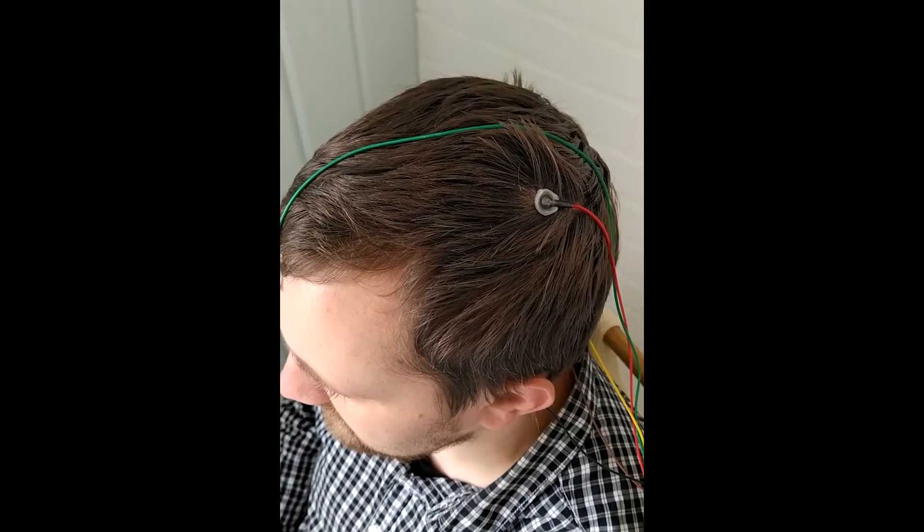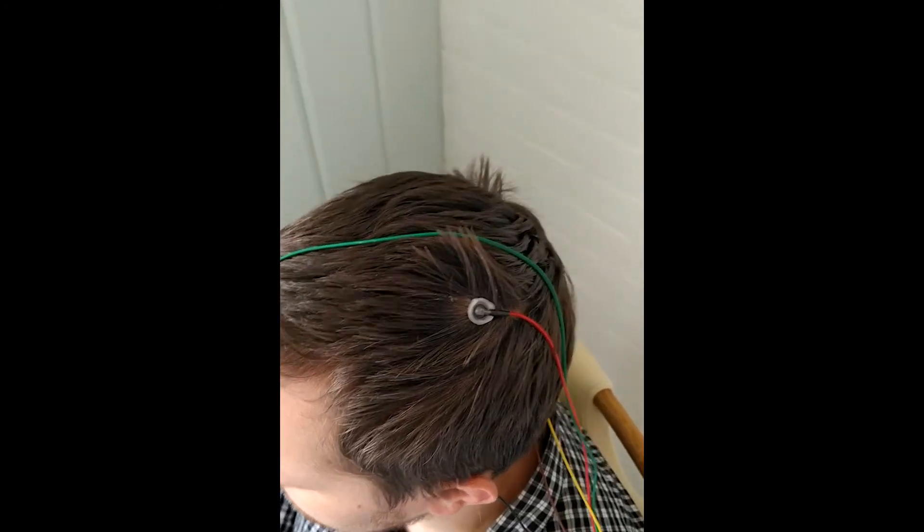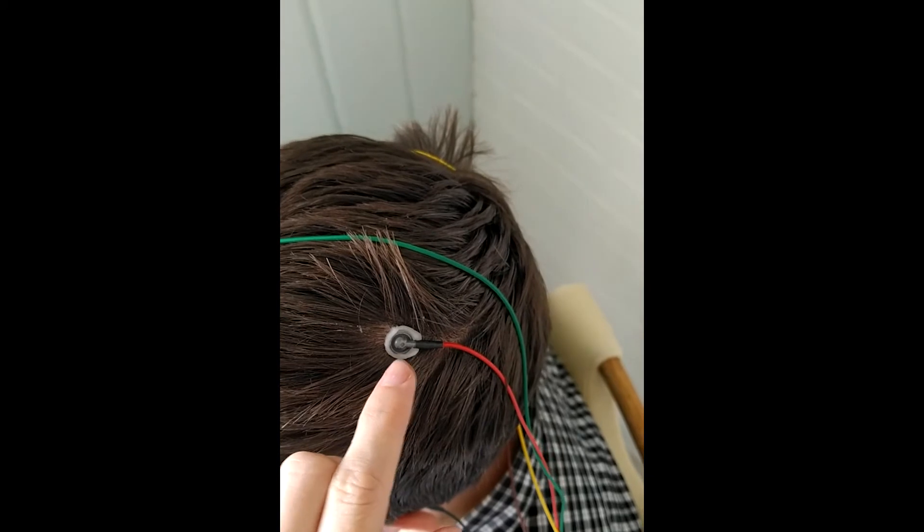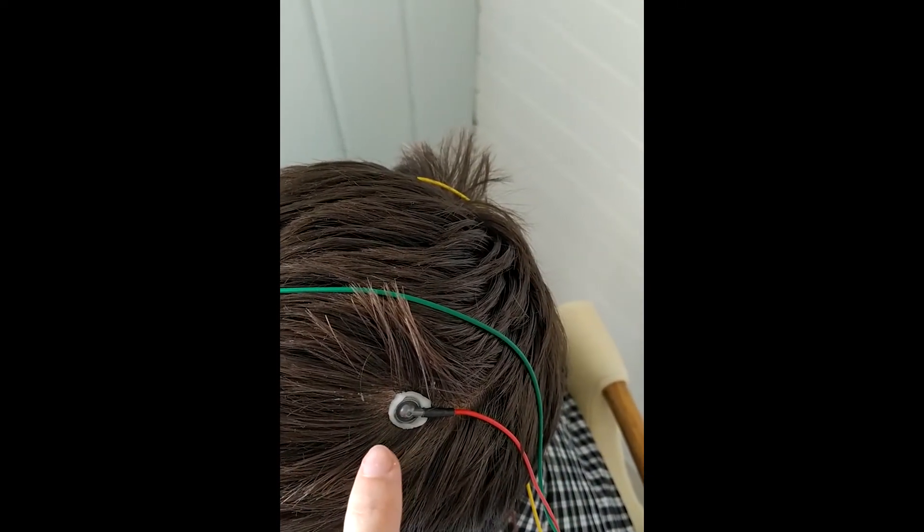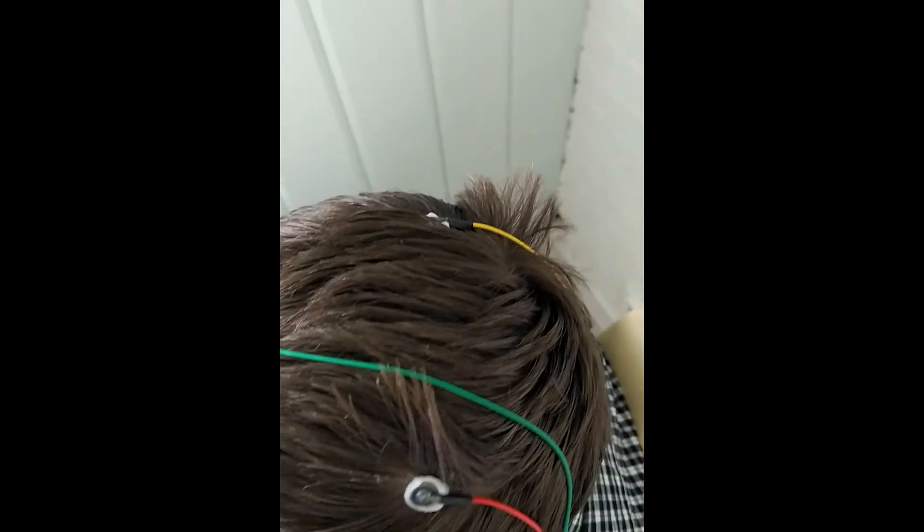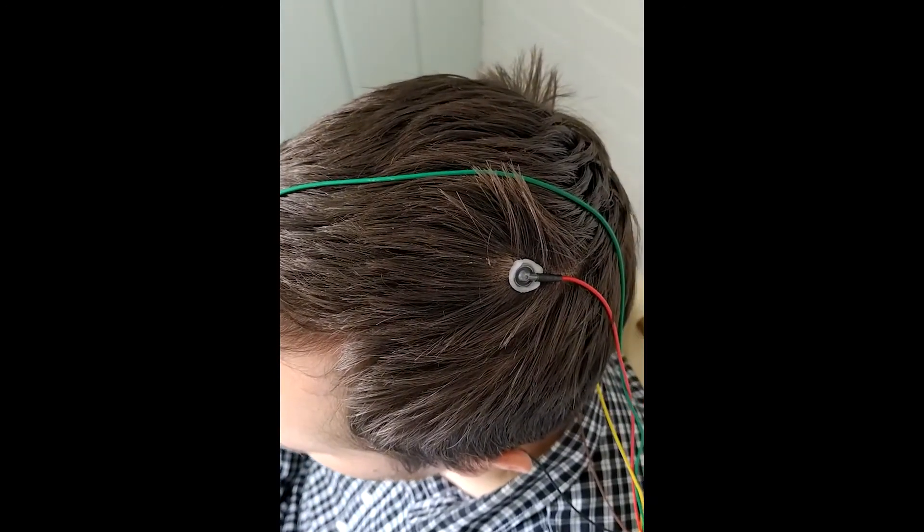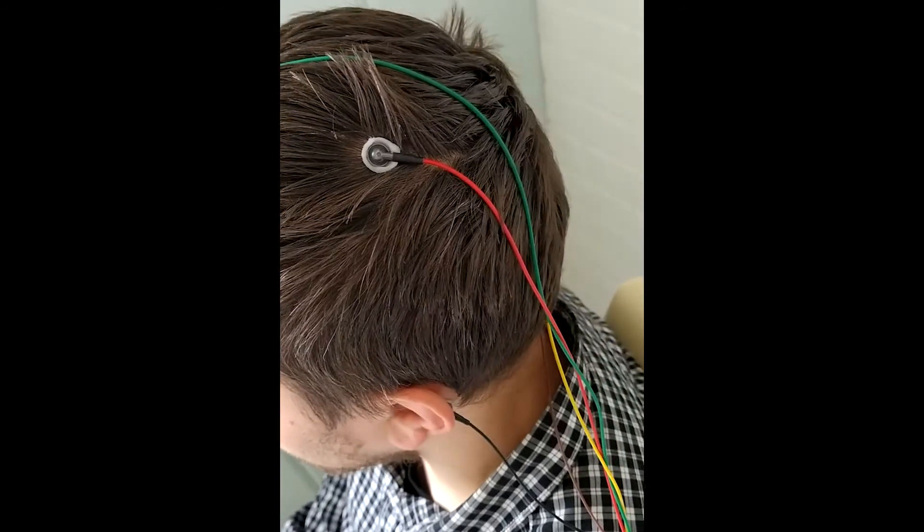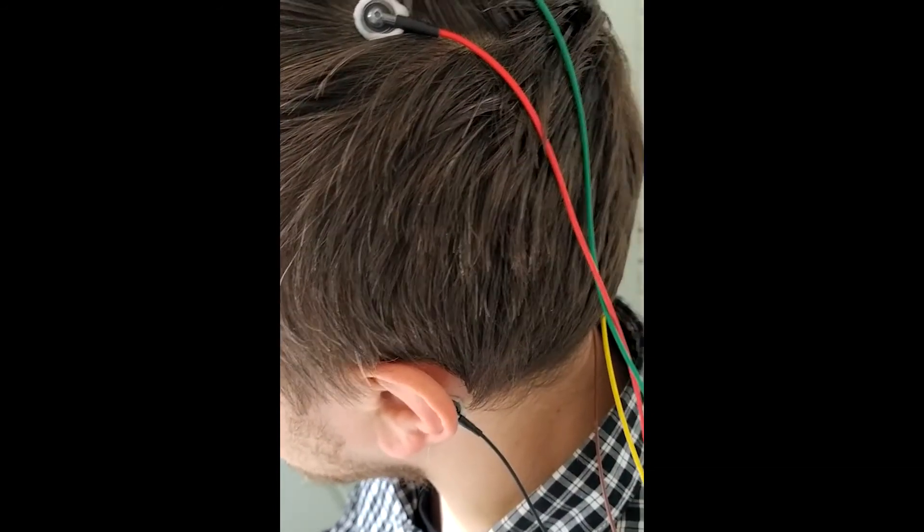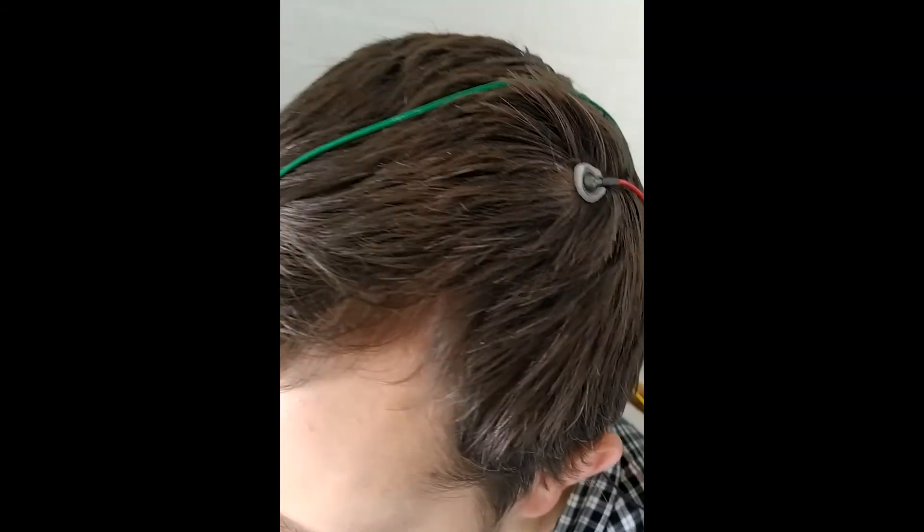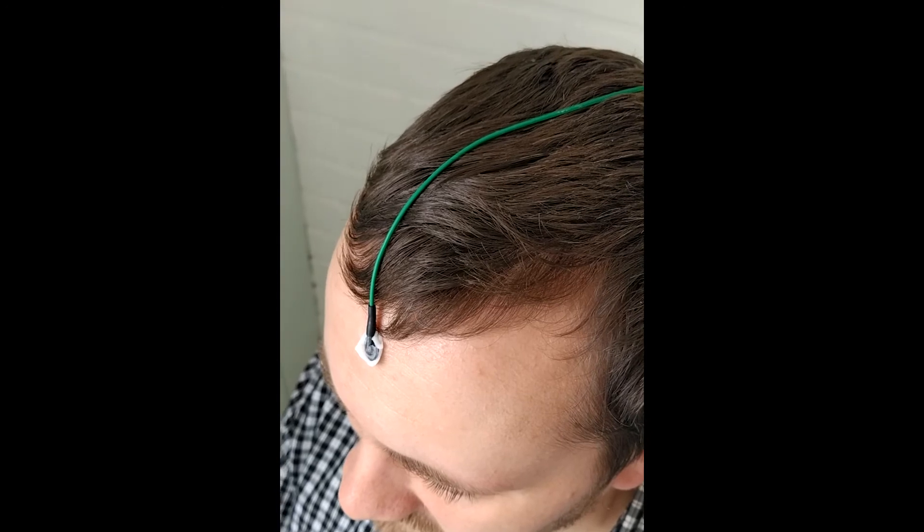We have used two-channel montage scheme. The active electrodes are put in the C3 and C4 sites according to the international 10-20 system. The reference electrodes are on the mastoids and the ground electrode is on the forehead.